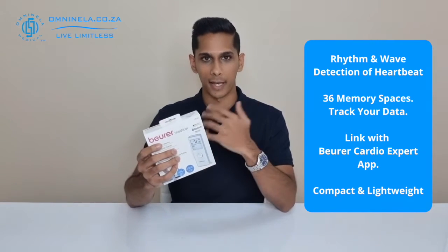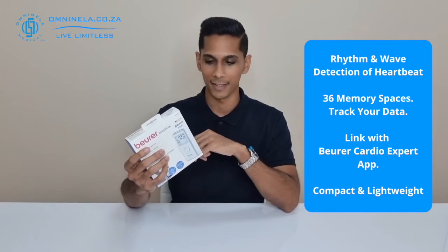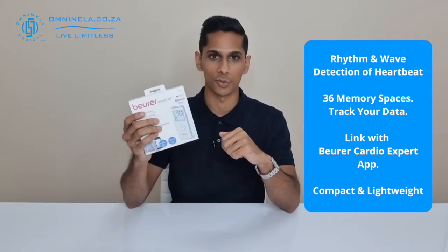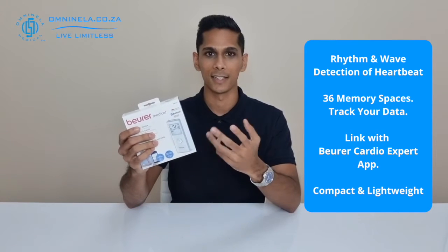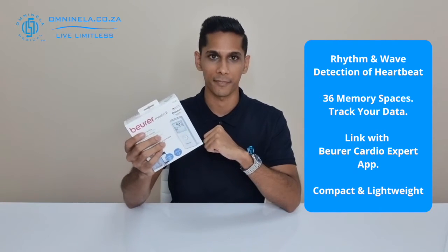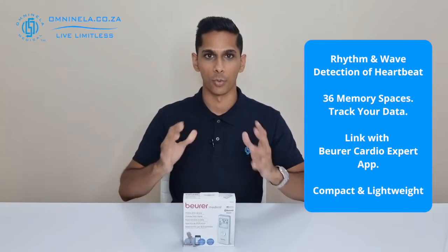In here we can see that it is an easy-to-use device. It comes with the batteries included and the USB cable included, and also has a five-year guarantee — so if there are any manufacturing defects with this device within those five years, you can let us know and we'll be able to assist you. So let's open this up and find out what items are included inside the packaging.